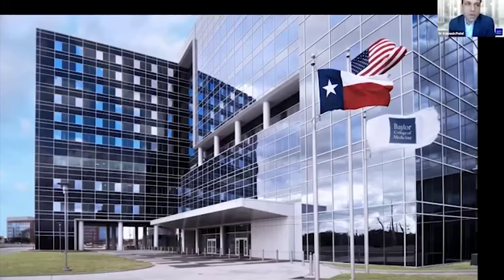So I have not spent a lot of time trying to target the perforating vessels, to be honest with you. One of the reasons is, unless you have at the same time a detailed venography to really see the entire network, it's not clear to me how I know which one I'm selecting is going to be the one that's going to resolve that varix.